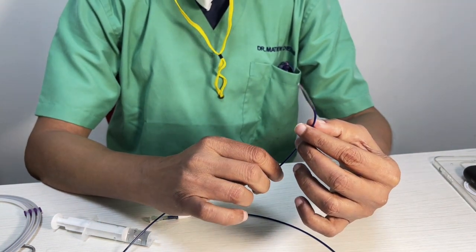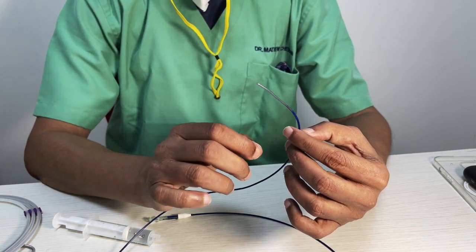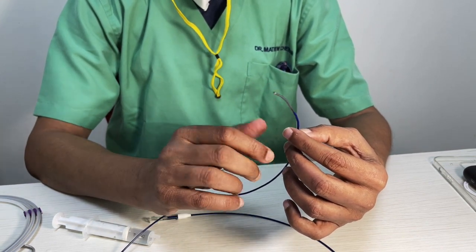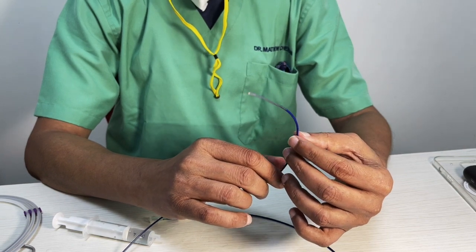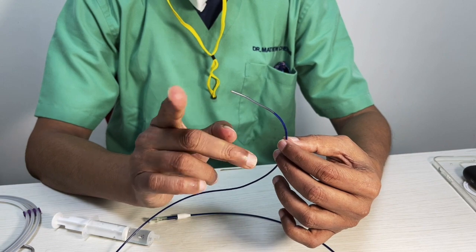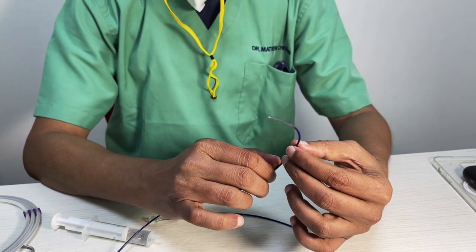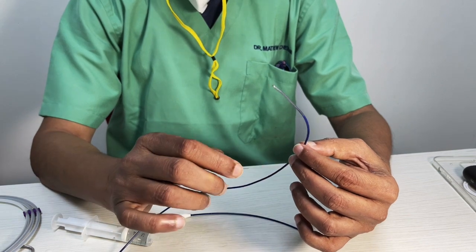So this is one of the best devices when you want to go really distal, when you want to put a stent, or you want to use, like I said, a device like a contour, and they come in 2 lengths. So decide your length properly. If you take a longer length, the microcatheter tip beyond it won't come. So if you're going to use it for a procedure like stenting, use the shorter length that is available.